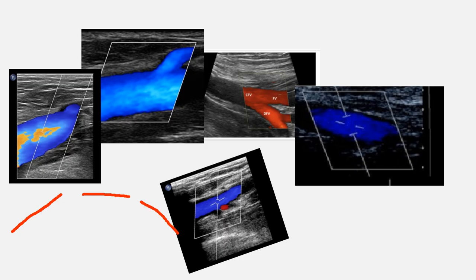We want to make sure that as we're changing that angle on our screen, that we are inverting the color flow appropriately. So this picture here, I would say to invert so that it appears blue like the rest of our vessels. This picture down here is showing us our sag popliteal vein. That should also be going up towards our screen. These images will make more sense once we start to do them in lab.